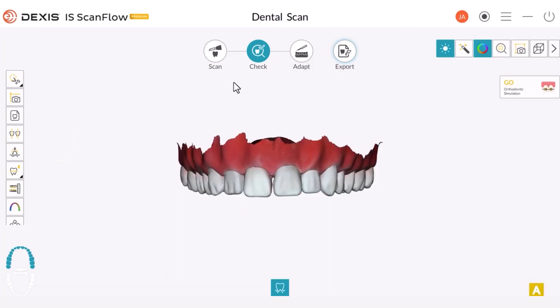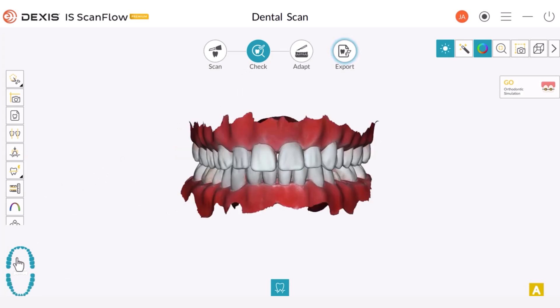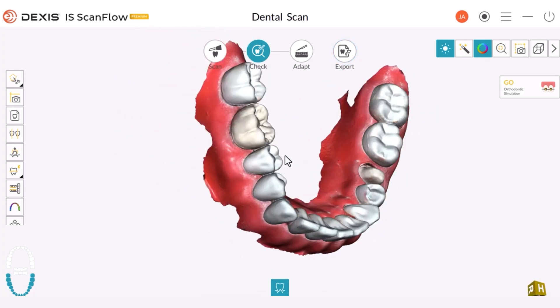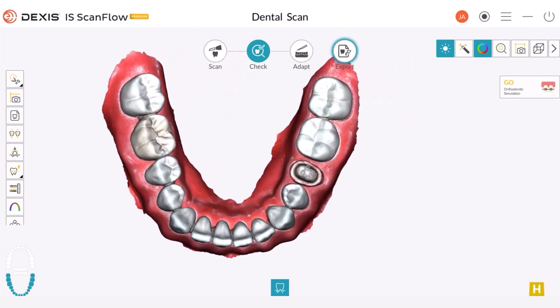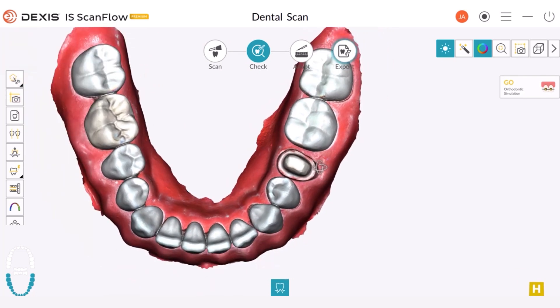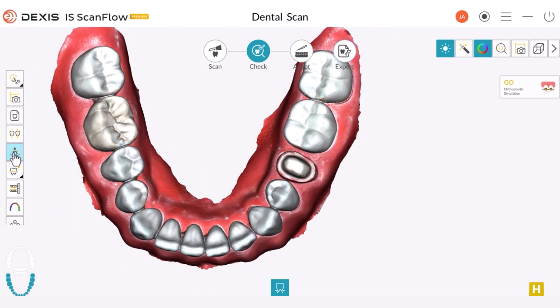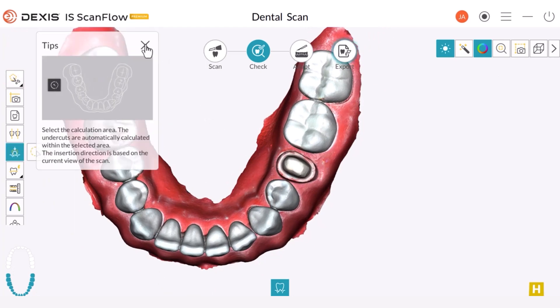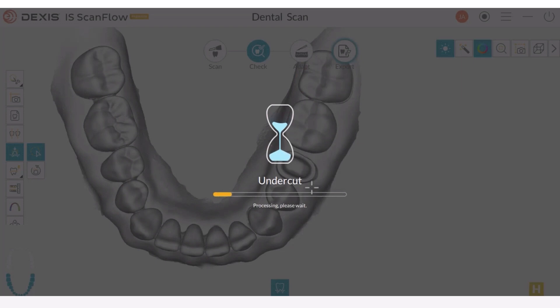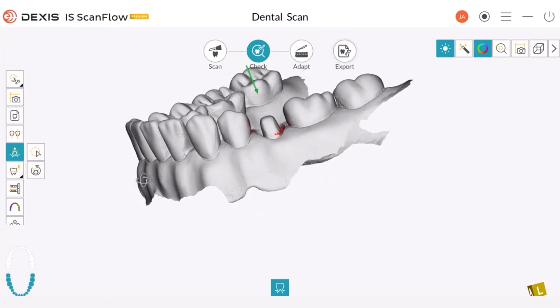Let's now explore the Undercut Check tool, which is only available during the check step. First, we need to select an arch. I will select the lower arch since this is where our prep is. Then we need to position the arch in the direction of the path of insertion that we want to have. We can zoom in or zoom out, whatever is more convenient. Then we can select the Undercut Check tool and engage a selection by left-clicking and dragging to include the prep tooth. The software checks for undercuts based on our selected path of insertion.